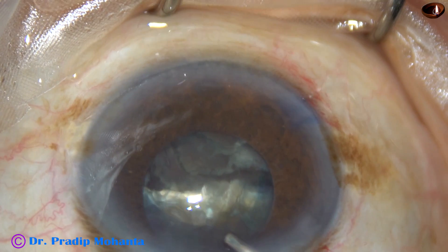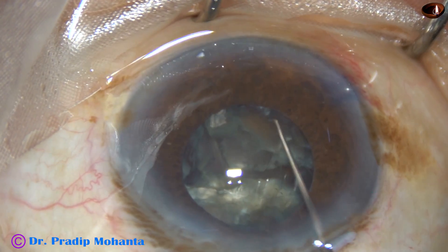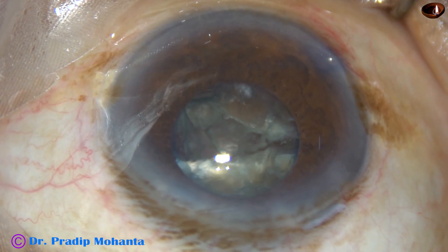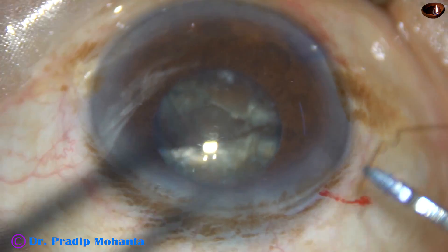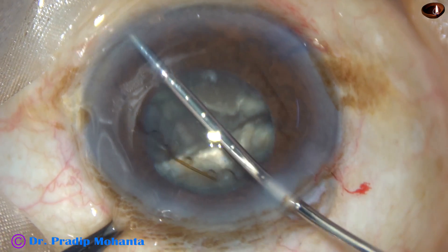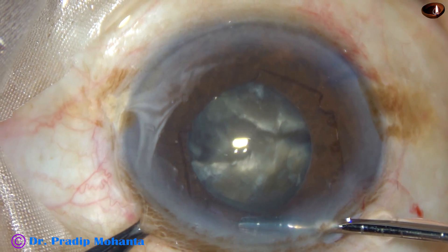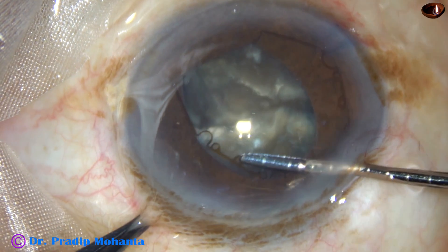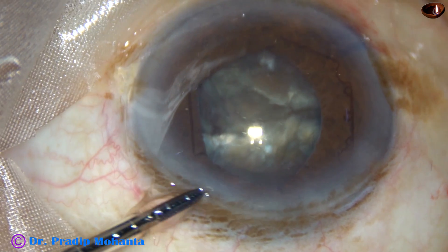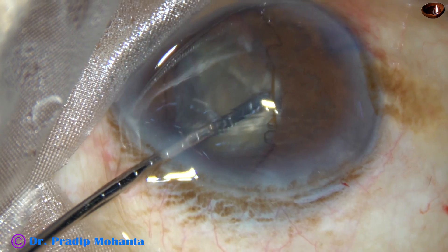But the pupil size has come down so much that I am not comfortable managing this nucleus without dilating the pupil to some extent. So I ask for a pupil expansion device — this is B-Hex. It is taken into the anterior chamber completely, and the leading flange is tucked. Through the main incision itself I tuck the flange centered at one o'clock. Now I go through the left side port and tuck the flange centered at ten o'clock.